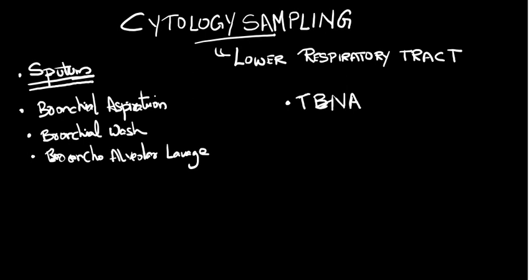and then the lymph node sample is taken. Naturally, if you are taking a lymph node sample with this technique, you have to check the adequacy, and adequacy can be seen microscopically by the presence of an adequate amount of lymphocytes. This is used for looking for any neoplasm that has metastasized to the mediastinal lymph nodes, or we can also use it for sarcoidosis and such conditions.